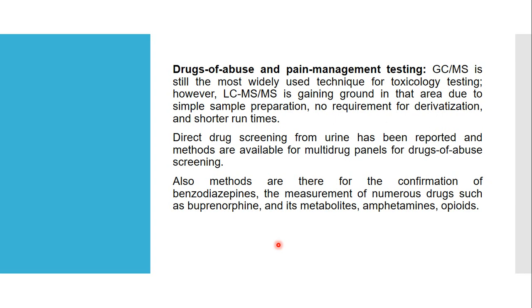Next application is drug of abuse and pain management testing. So for this purpose, GC-MS is still most widely used, but LC-MS is gaining ground in that area due to simple sample preparation, as we have discussed in advantages. Here there is no requirement for derivatization and shorter run times. Direct drug screening from the urine has been reported, and methods are available for multi-drug panels for drug of abuse screening.